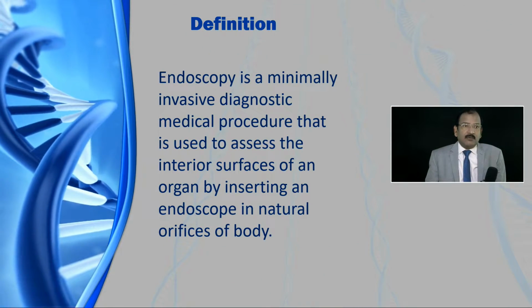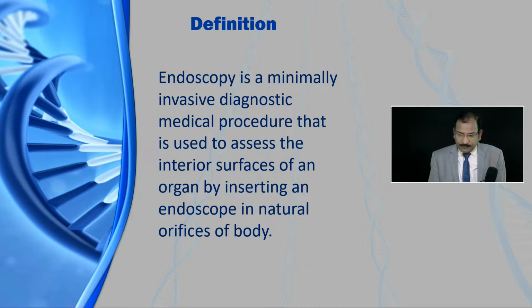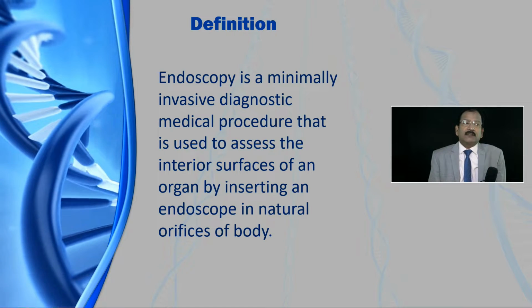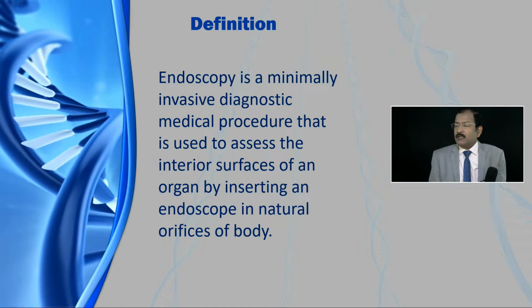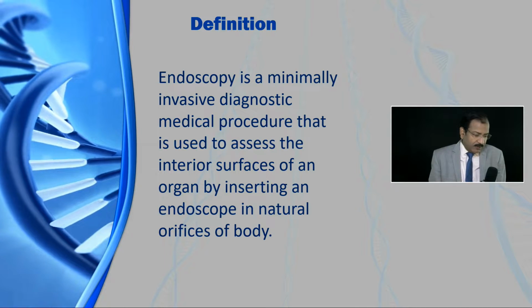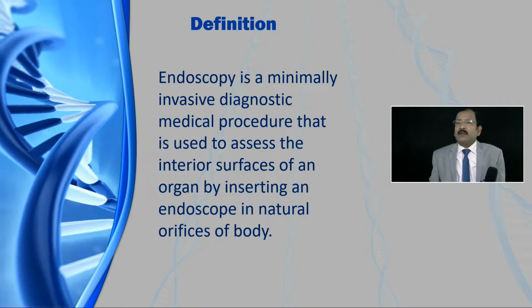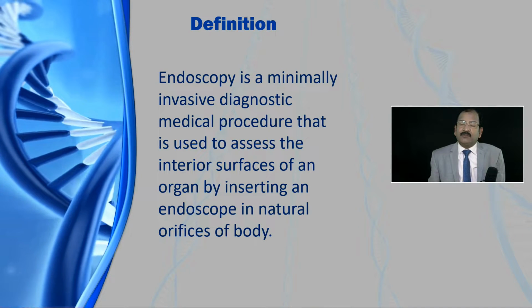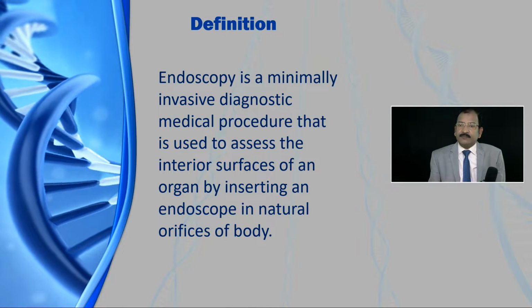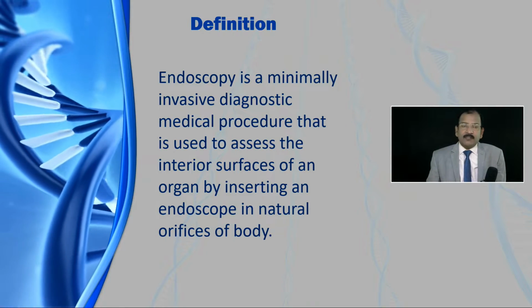Definition you already know. It's a minimally invasive diagnostic medical procedure used to assess the interior surface of a hollow organ through the natural orifices of the body. So this is the definition of endoscopy. Endoscopy alone is a diagnostic medical procedure. If you do any operative thing, it will be called therapeutic endoscopy. But endoscopy alone is a minimally invasive diagnostic medical procedure.